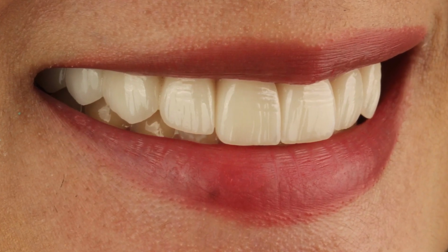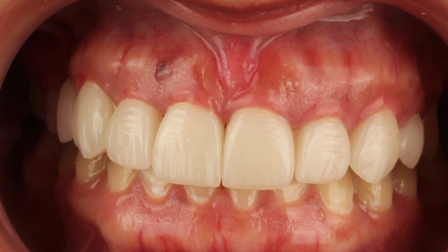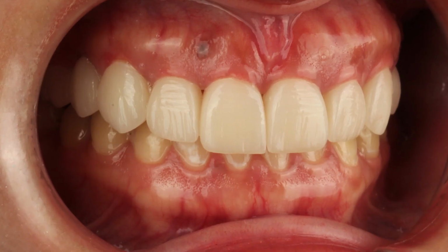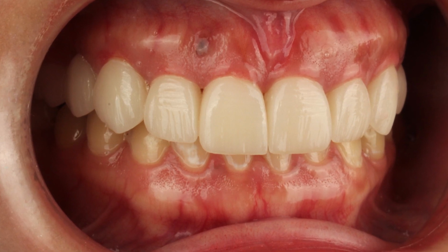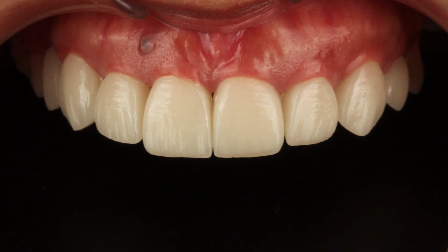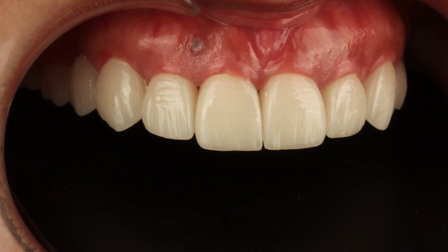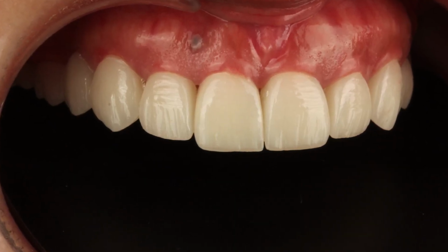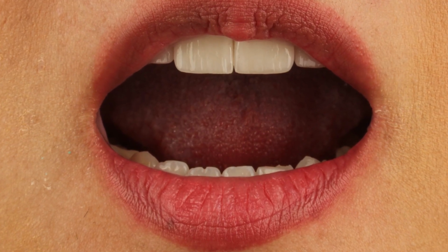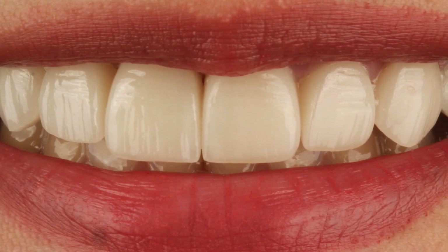So this is a combination of veneers, crowns, and bridge. And the color is not too white, it's A1, and a lot of translucency just to create balance. And also, it's very durable. The patient can eat normally, and it's stain resistant. There's no parang problem with mga discoloration, especially with coffee drinker or tea drinker individual. So ito, very beautiful and good material of choice.